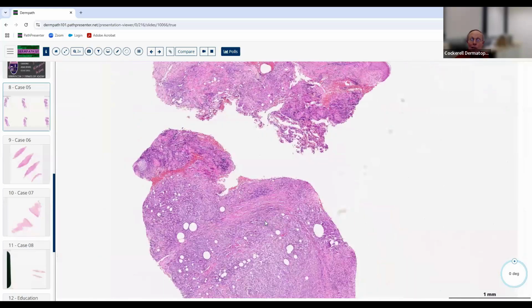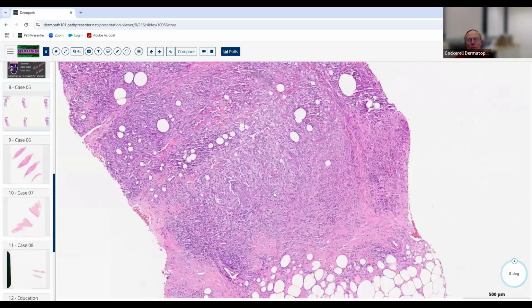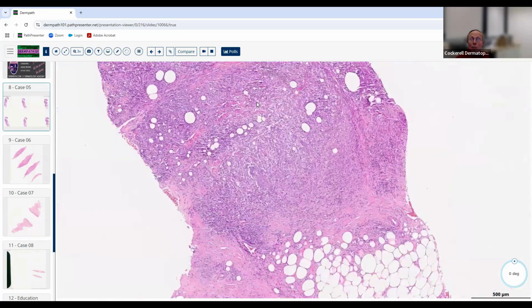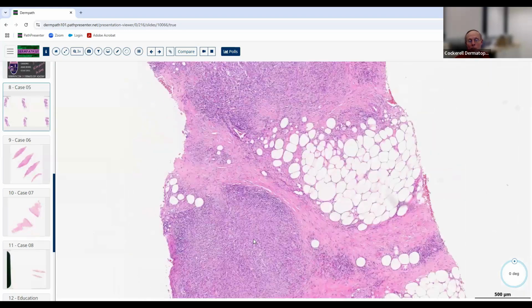And this is a more characteristic kind of inflammatory reaction that you get with that. So you wouldn't just know that without getting additional information. The boards are not going to show you this and say the diagnosis is blank. But just so you'll know, when you're looking at an unknown slide and you don't see a lot of epidermal involvement, think that it's more likely to be something like an atypical mycobacterial infection than a classic deep fungal infection here.